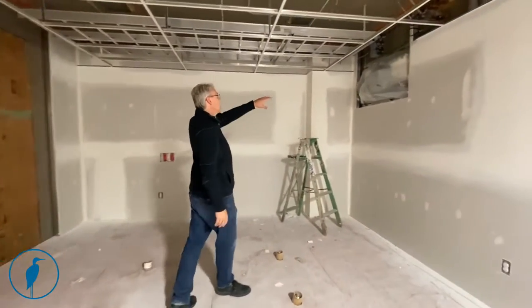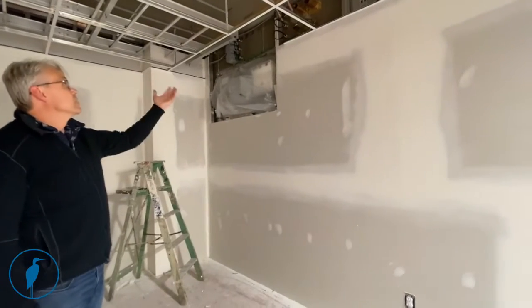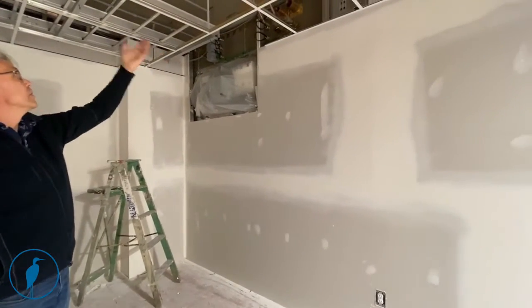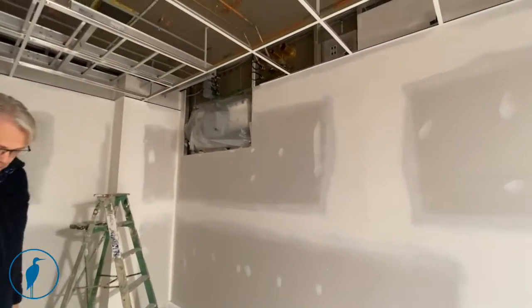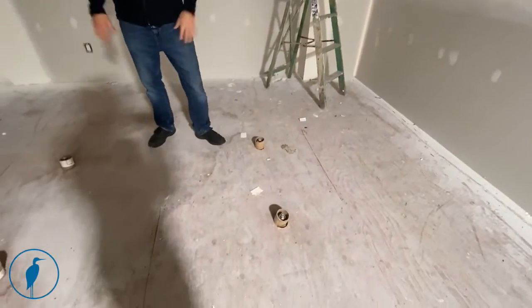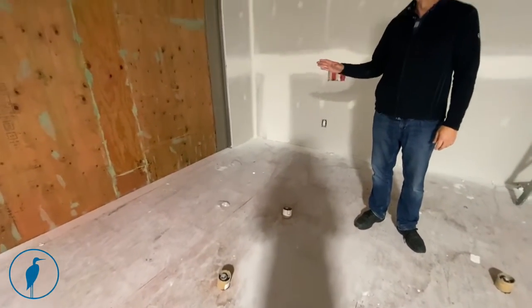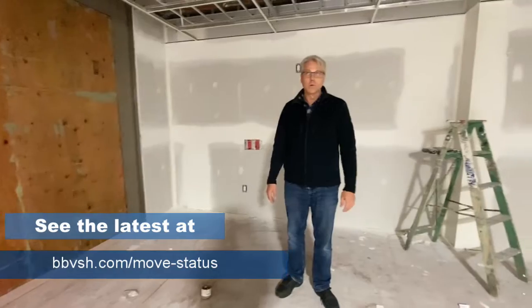There's cable trays in place, the RF panel where all the systems come through the wall are in place, the medical gas is in place. The anchors are seismic into the ground so that the MRI can sit on it. The floor is waiting — there'll be a static dissipating vinyl covering for this floor.